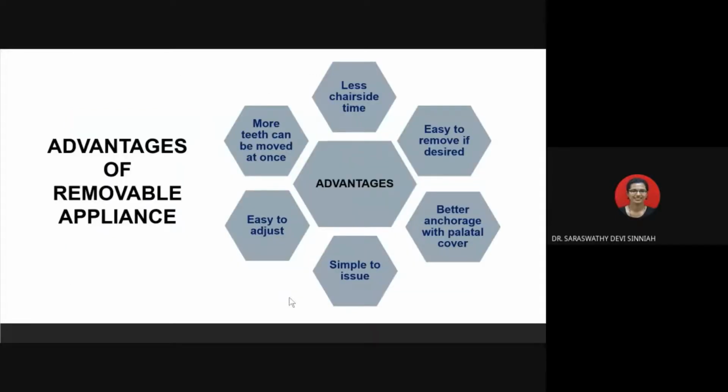Well, why do we use removable appliances? There are several advantages. Firstly, the appliance is fabricated in the laboratory in advance of the appointment. So during the appointment, only fitting and adjustment will be done. Therefore, the chairside time is reduced.